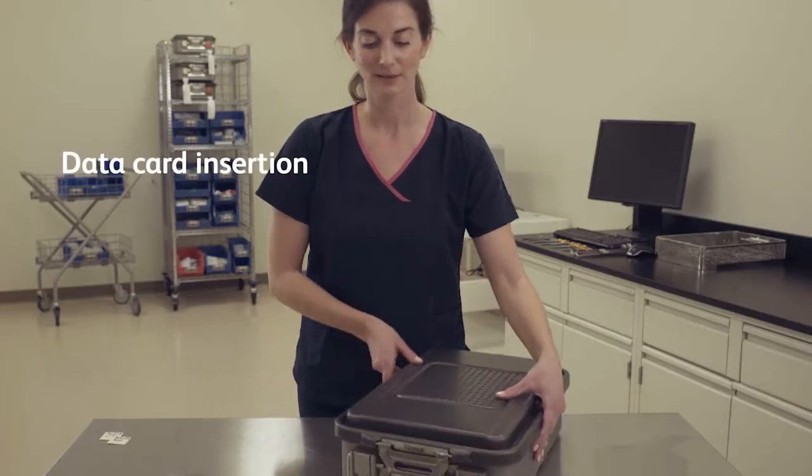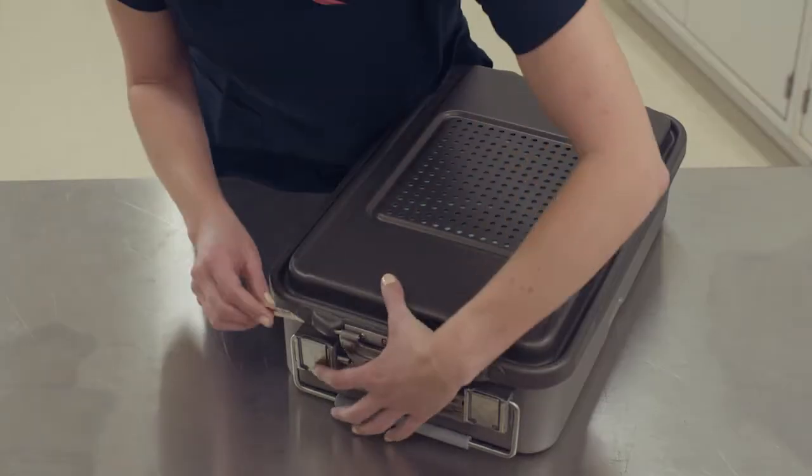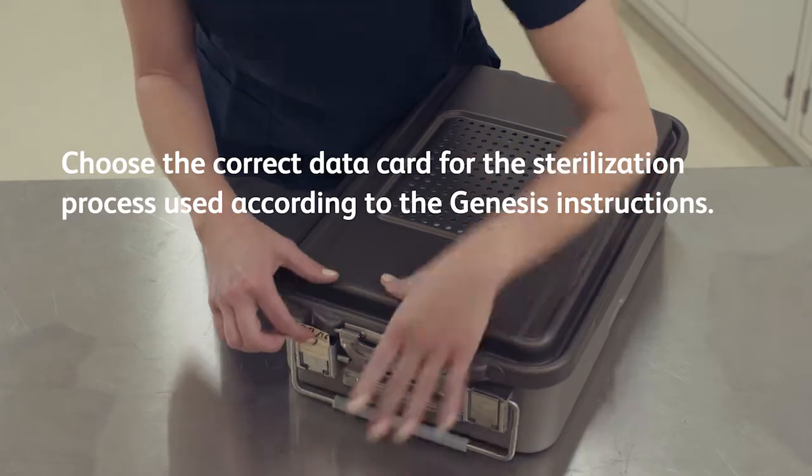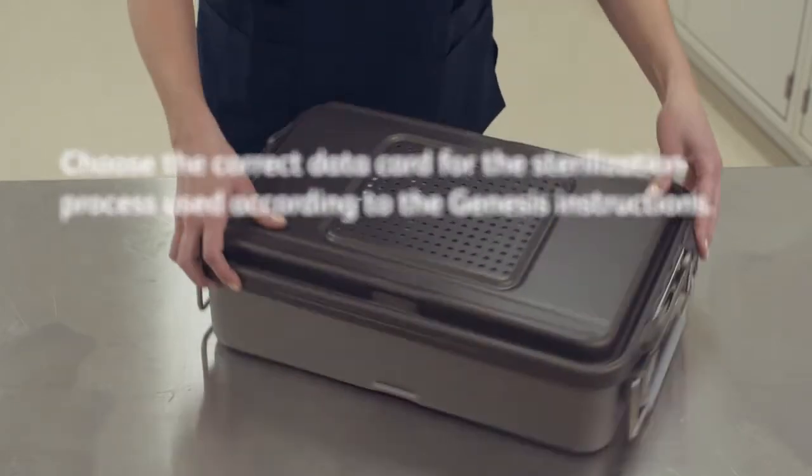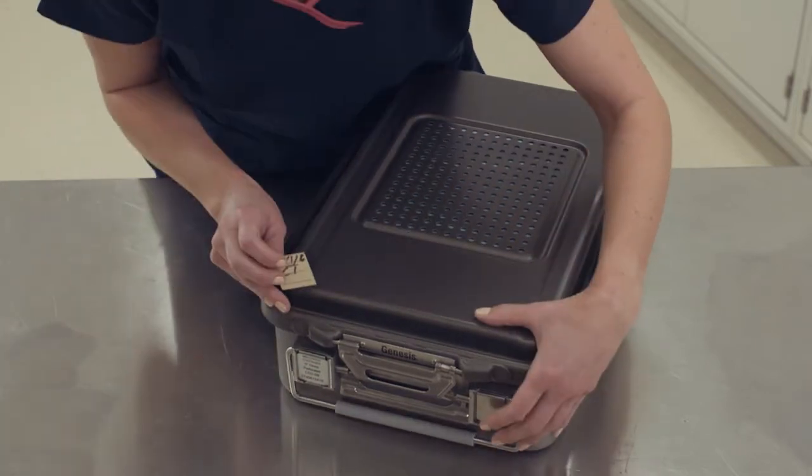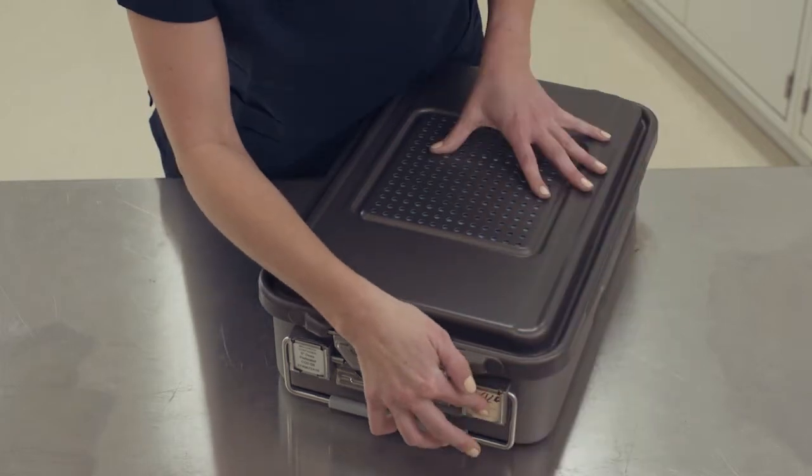Data cards are used to record processing information such as load number, date processed and expiry date, according to your facility's protocols. Insert the data cards into the blocks located on each side of the container bottom. Placement will allow for easy visual access during storage and transport.